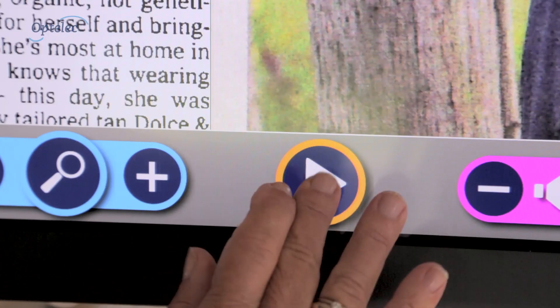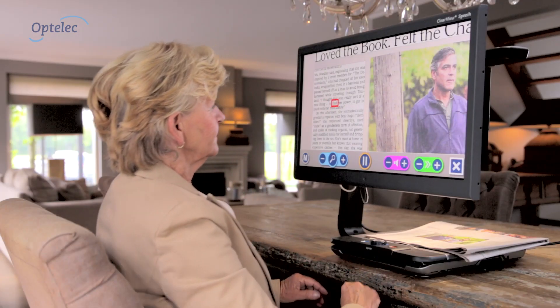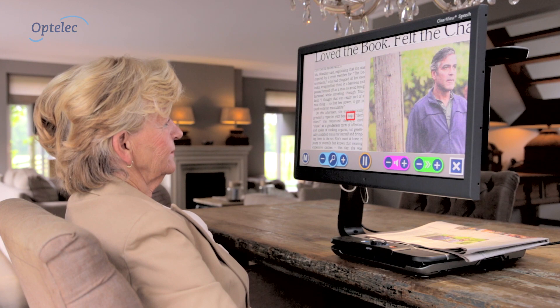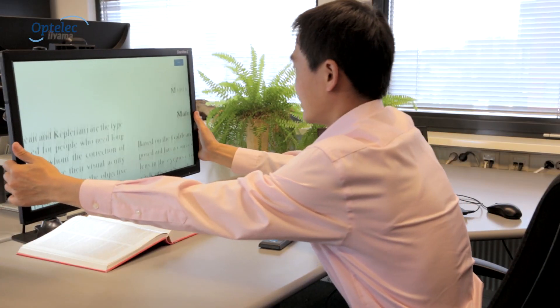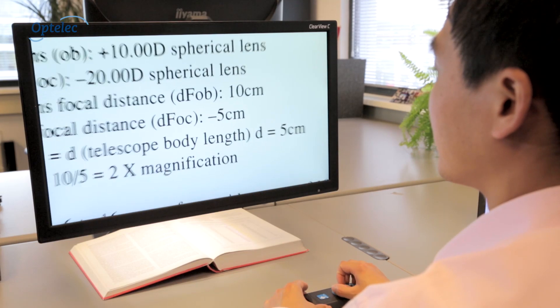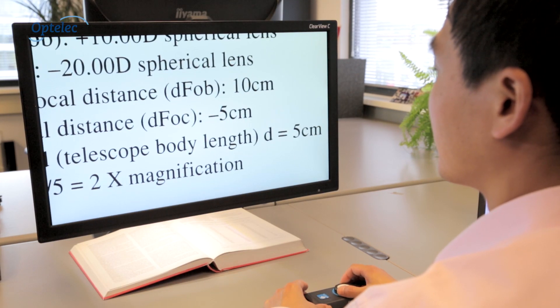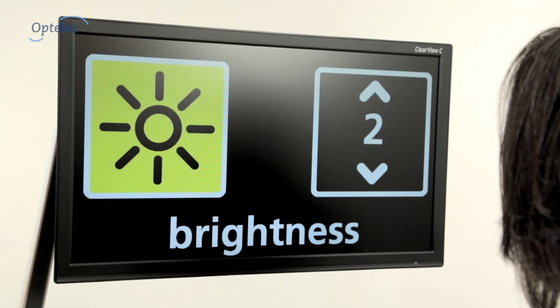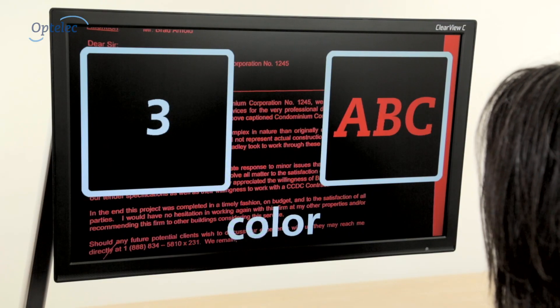Or use the speech module which allows you to sit back and listen to text as it is read aloud. Choose the optional flex arm for a flexible workspace. The Clearview C is the perfect video magnifier. With 14 different configurations there is always a Clearview C that suits your needs.